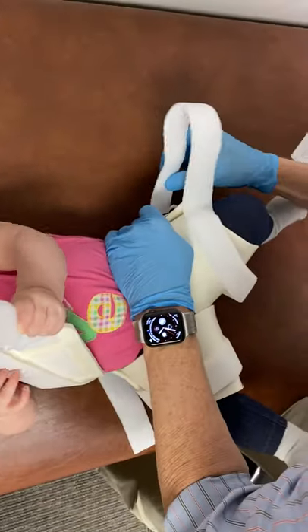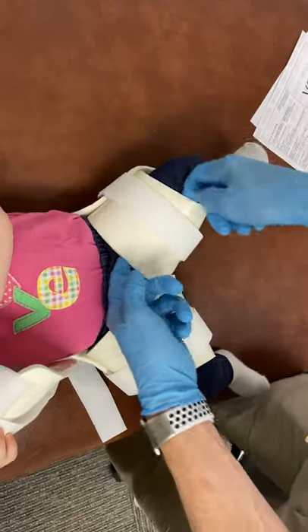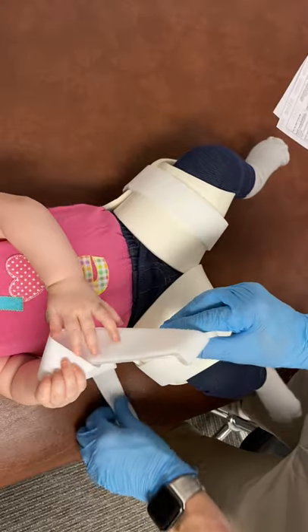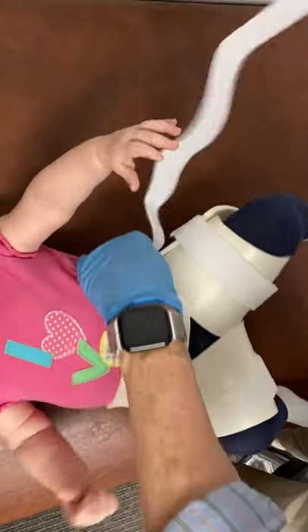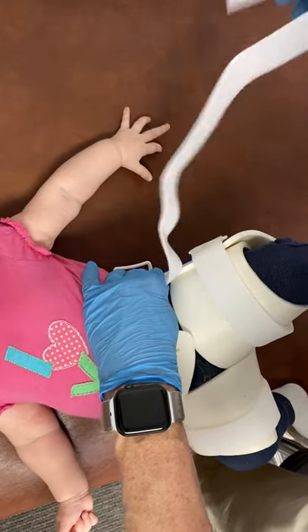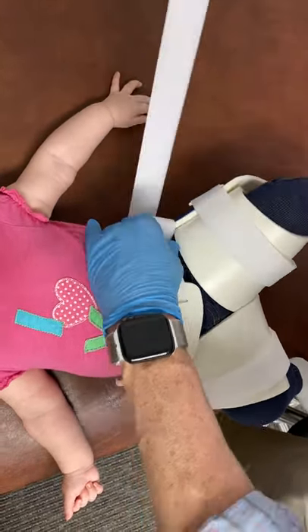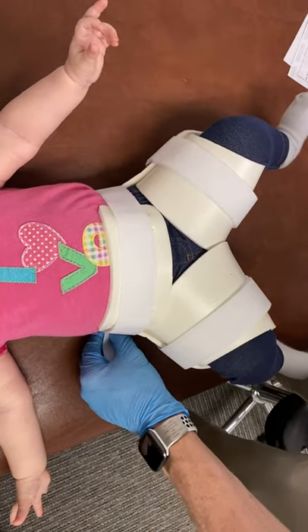Then take this one here and go straight through this buckle. Same thing — not super tight, we're not trying to make a tourniquet, just snug enough to hold the legs out. Then this one is going to find the little buckle way over on this side, so tilt a little bit, feed this strap through, close the strap, and we are completely finished.